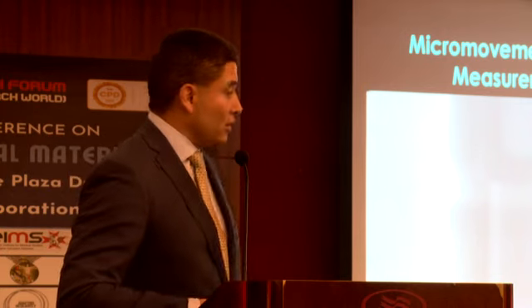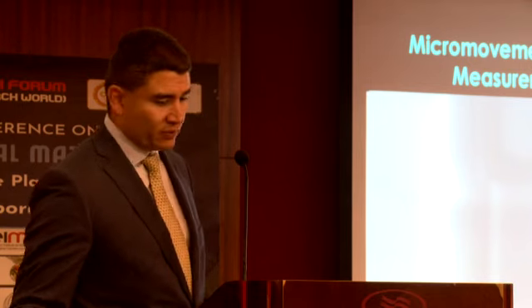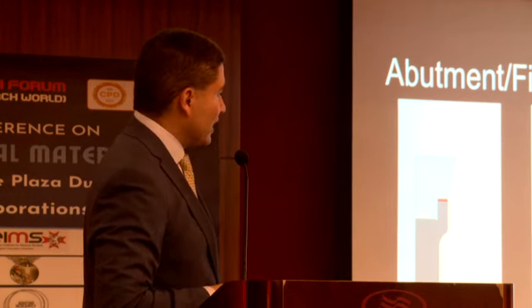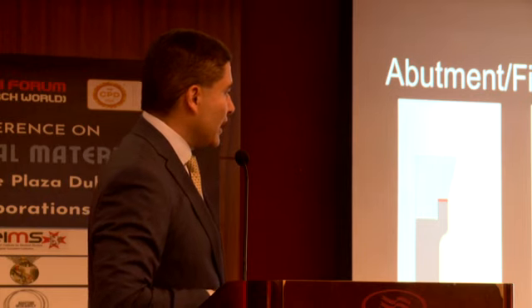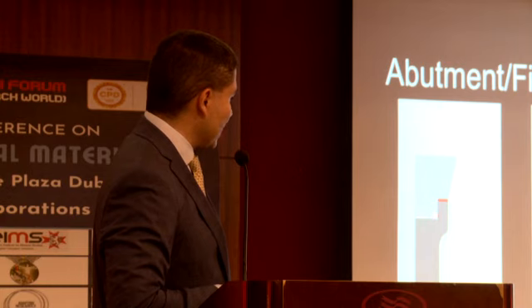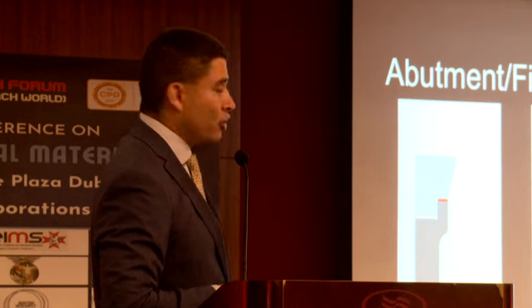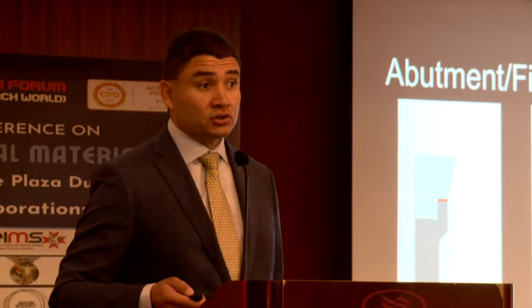So what that means for us is that if we were to select an implant, we should select an implant with an internal connection that is longer and has a more taper effect; the less micro movement you will have. However, in external connection implants or internal connection implants that are straight connections, like this, or external connection, the micro movement is going to happen readily, and that will contribute to the amount of physiologic bone loss. So now I'm telling you how to choose your implant.